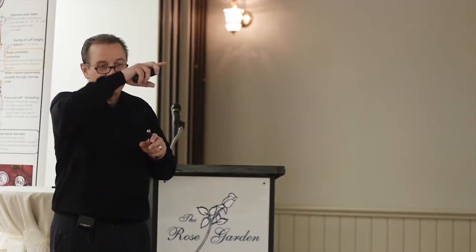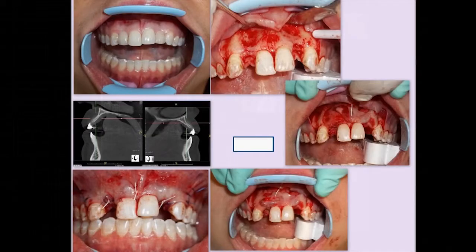There's too much morbidity associated with it. And it's a headache. And you go into the chin and you do all this stuff and you get the bone out. By the time you get done, it's like, man, there's not that much there. That was a lot of trouble. And so nowadays with the sonic weld and some of the things that are out there, we're able to develop these sites predictably.